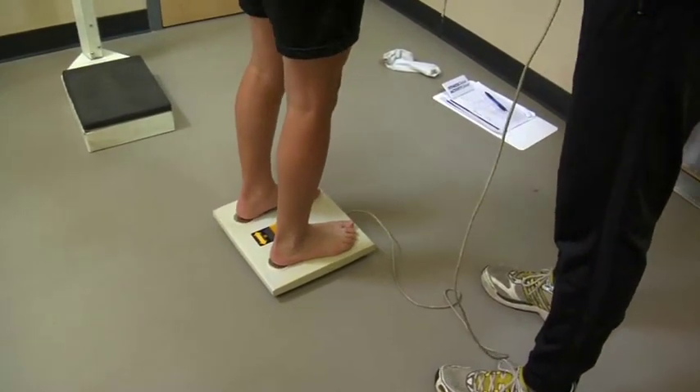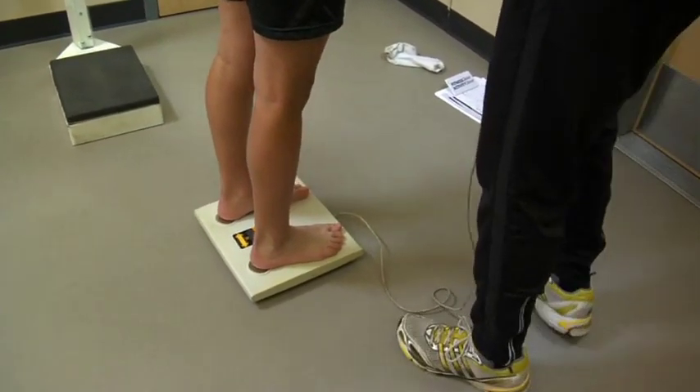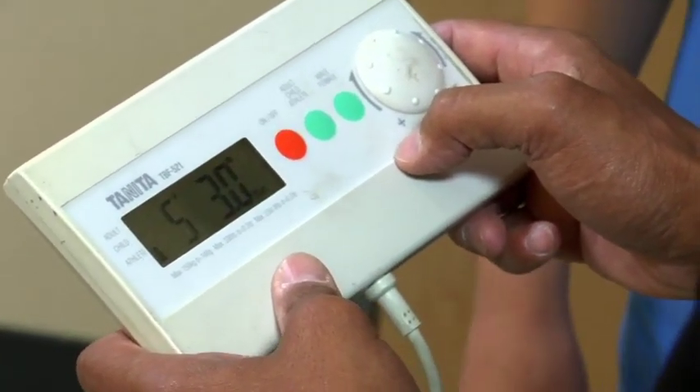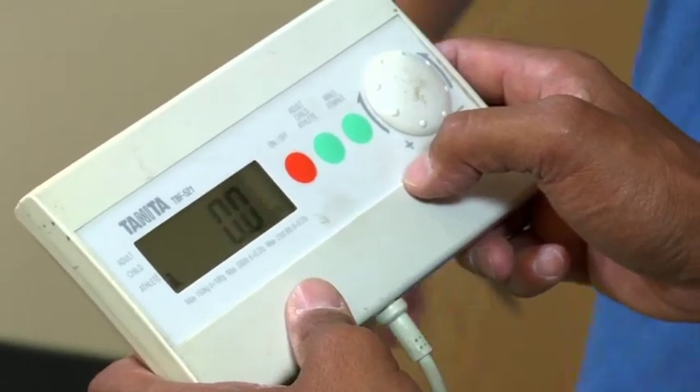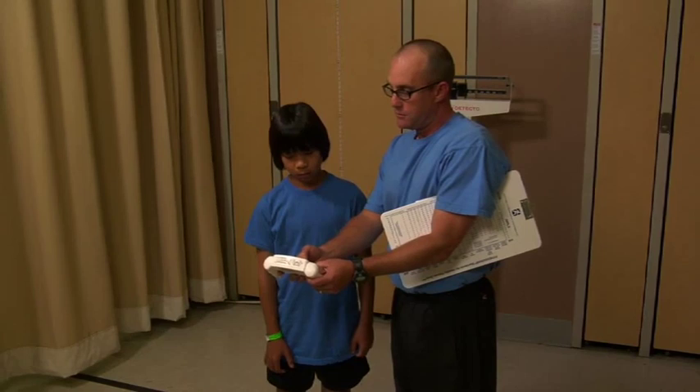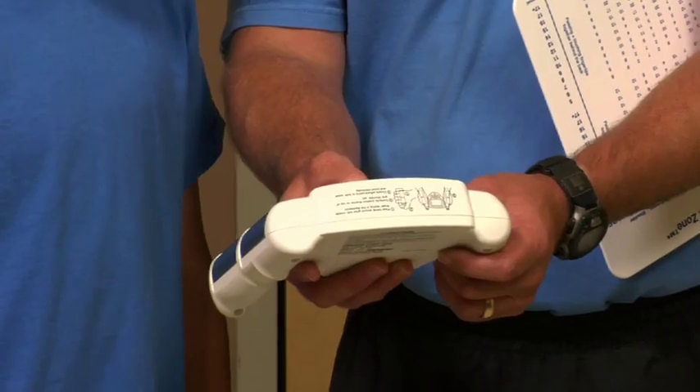Although specific training in using Bioelectric Impedance Analyzers is not required, to get an accurate estimate of body fat, it is important that the examiner enter all the correct data for the student. Once the examiner has entered the required data into the Bioelectric Impedance Analyzer, it is ready for the student.